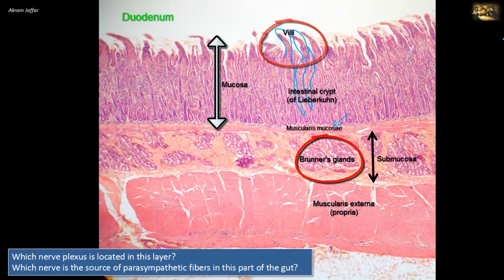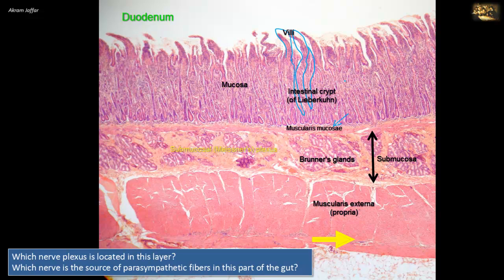In the GI tract, autonomic plexuses are present in two places: in the submucosa, and between the two layers of the muscularis externa. The submucosal plexus is called the Meissner's plexus, located in the submucosa as indicated in this slide. It supplies the mucosal glands, like those present in the duodenum, as well as the smooth muscles of the muscularis mucosa.